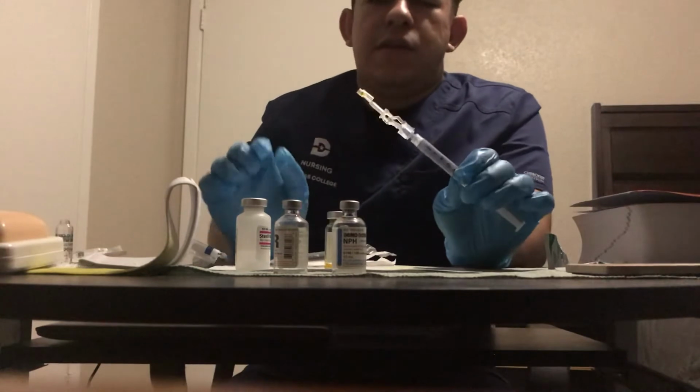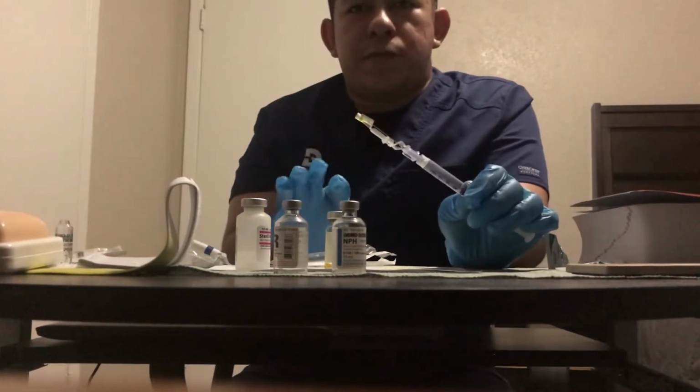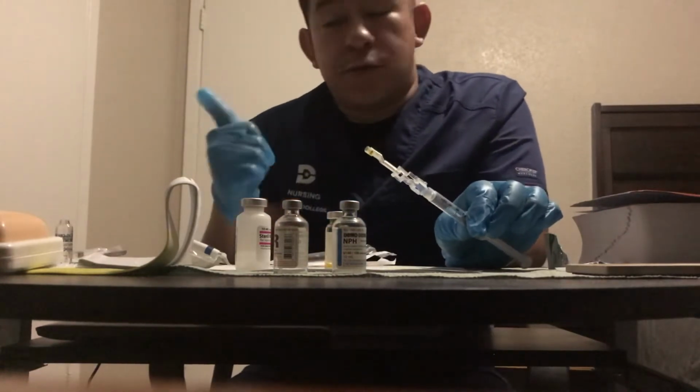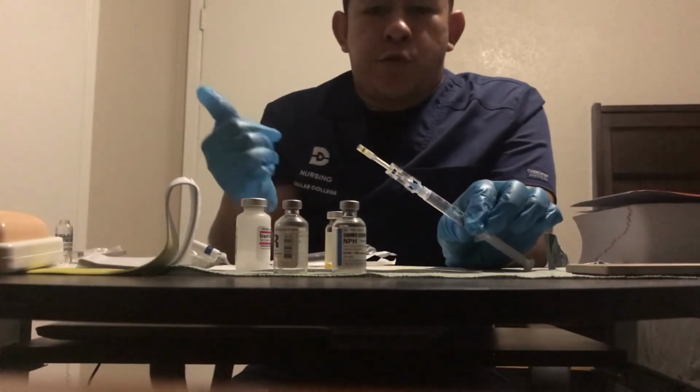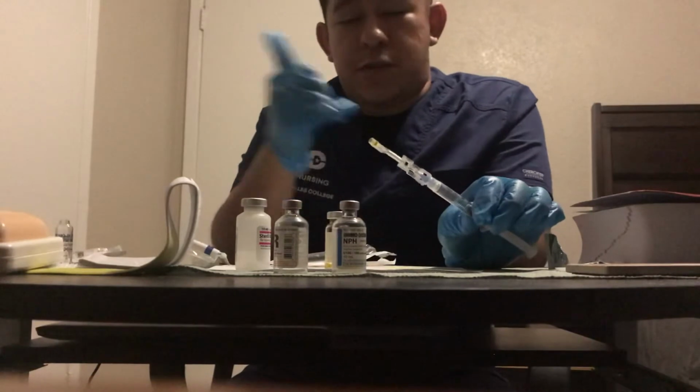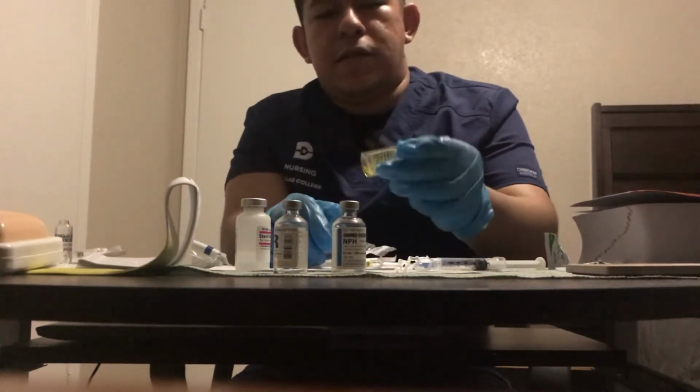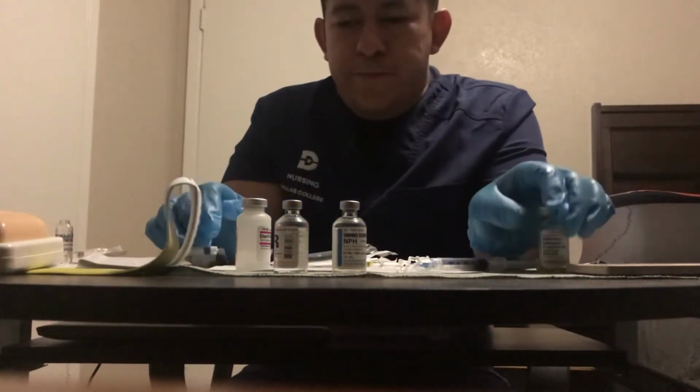So in this case, since I'm in the medication room, I'm just gonna recap it for now, and then I'm gonna grab a new needle to take with me into the room, and I'm gonna label it since I'm still taking it to the room. And this I would just dispose of properly.